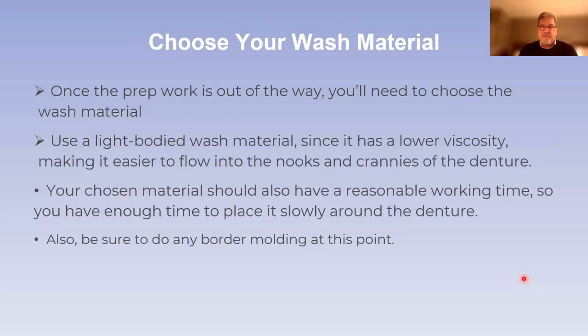So once the prep work is out of the way, you'll need to choose the wash material. I recommend a light body wash material, PVS material. It has a lower viscosity, which makes it easier to flow into the nooks and crannies of the denture. The chosen material should also have a reasonable working time, so you have enough time to place it slowly around the denture and put it in the patient's mouth. And be sure to do any border molding before you put it in the patient's mouth.